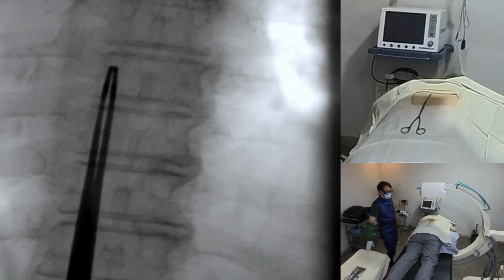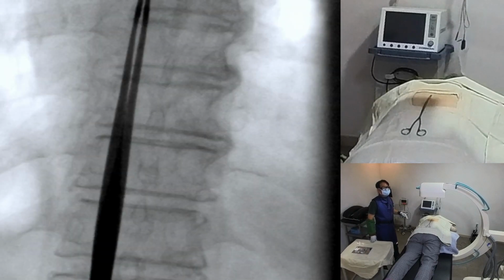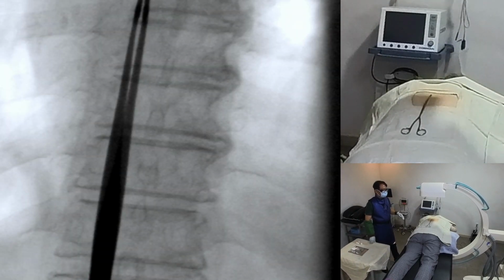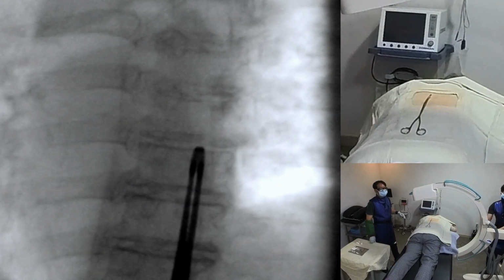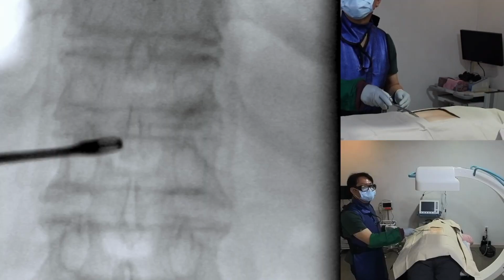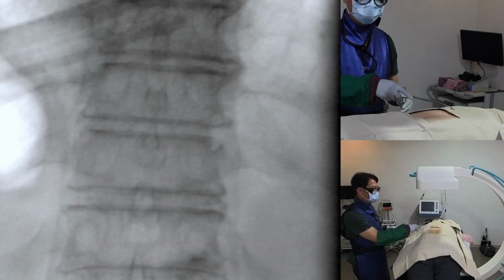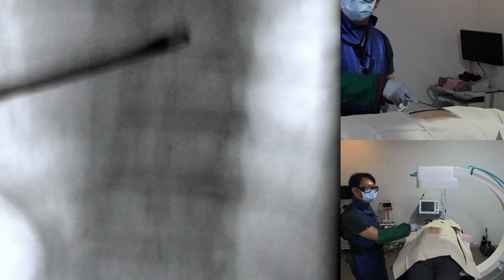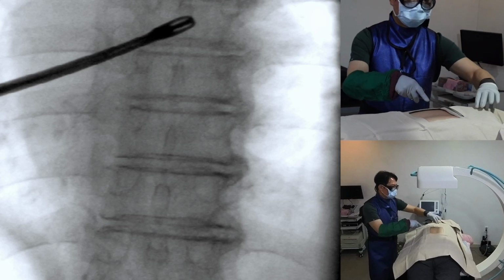To begin, I use the AP view and count up from T12 to locate the correct thoracic level if I previously informed the level by the imaging studies or other clinical information. There are no specific landmarks in the middle of the thoracic spine, so starting from T12 is necessary. Next, I will count up from T12, T11, T10, T9, and T8 and then put the long forceps to the target level under C-arm guidance and undergo the procedure.